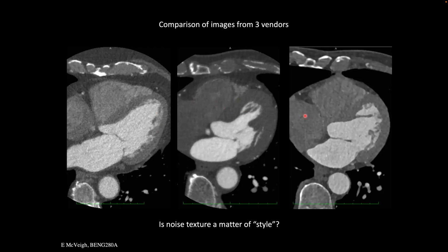Which one of these three do you think has the highest modulation transfer function, in that the greatest spatial frequencies are getting passed through? If you were to guess, how many people would say this one? Put up your hand. How many would say this one? And how many would say this one? Okay, only like 6 people voted. How can we make a decision? We don't have a quorum, right? We need a quorum.